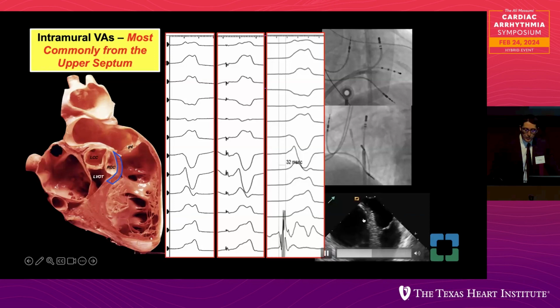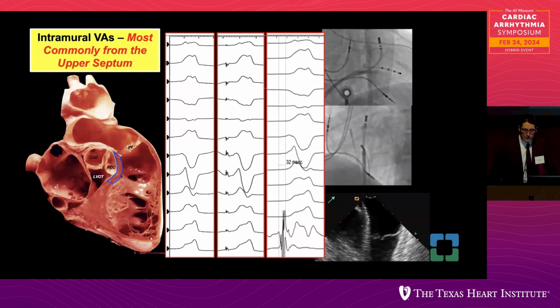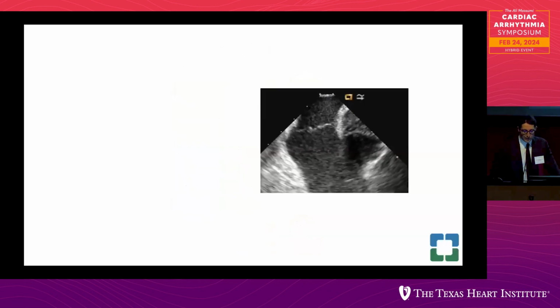And here you see on the opposite side, between the right and the left coronary cusp, the right-left junction essentially. So you know you're posterior on that side. You have an early activation here. And in general, anything that is earlier than 30 milliseconds, usually you're able to make an effect in terms of the ablation with success.